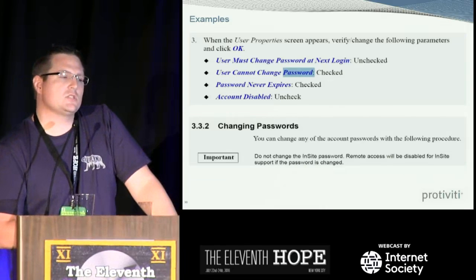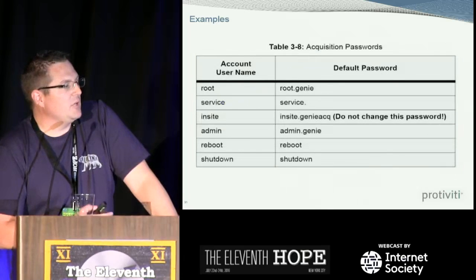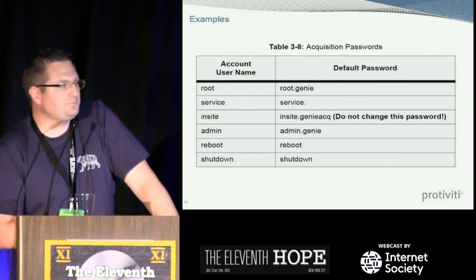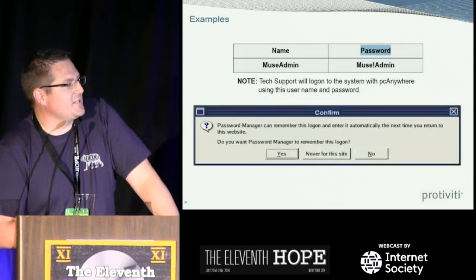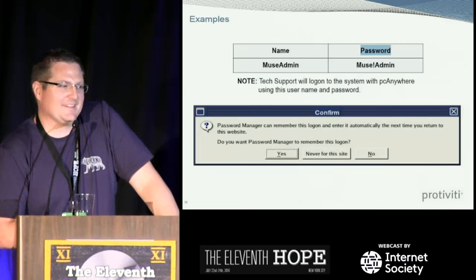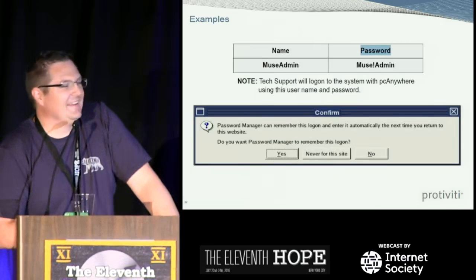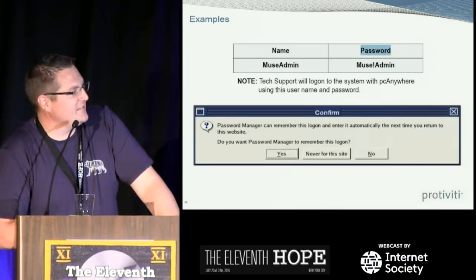So there are still issues that we see that are common here. Here's another one, again in big and bold, do not change this password. Another one, hey, tech support will log into your system with our backdoor account and use this username and password. And hey, doctor, I know you love remembering passwords, so just click yes and you won't have to ever enter it again.